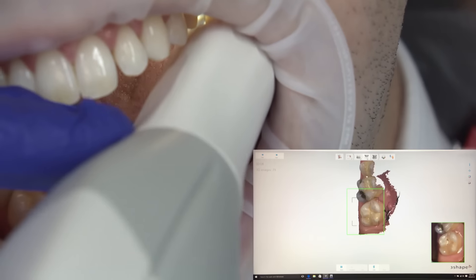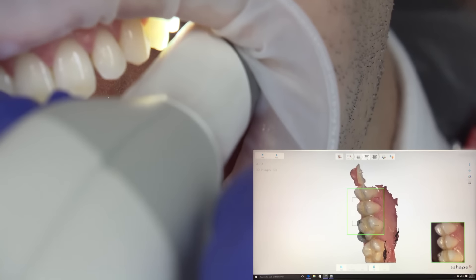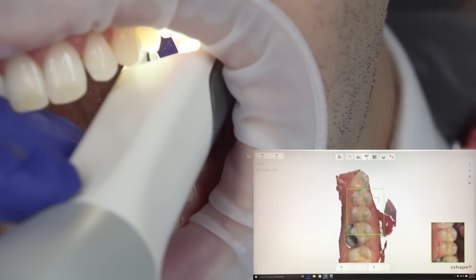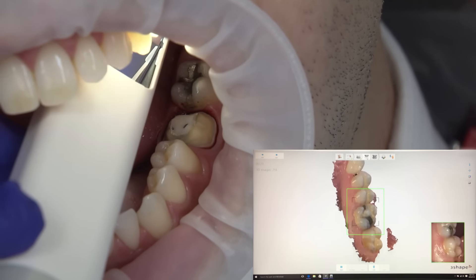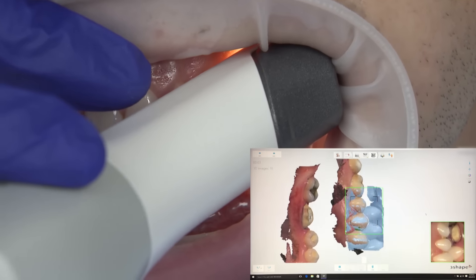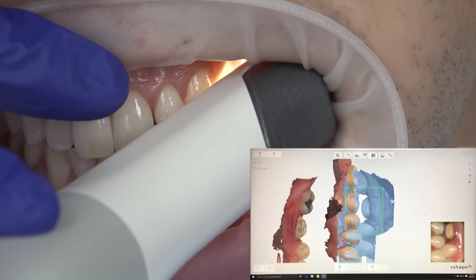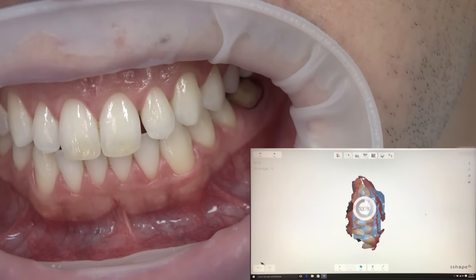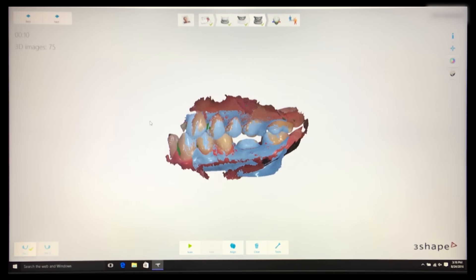From the occlusal, a slight tilt to the mesial and to the distal fills in the missing areas on the contact surfaces of the adjacent teeth. As with all other digital impression systems, there are usually three sets of scans that the system needs. After the prep, the opposing quadrant is scanned in, ensuring that all of the occlusal, buccal, and lingual areas are scanned that are opposite the prep site. The third set is acquired with the patient biting fully in centric and taken from the buccal. Once the software recognizes similarities between the previous two scans and the bite, it will automatically stitch all the pieces together.